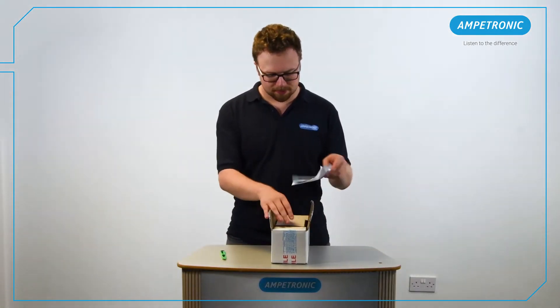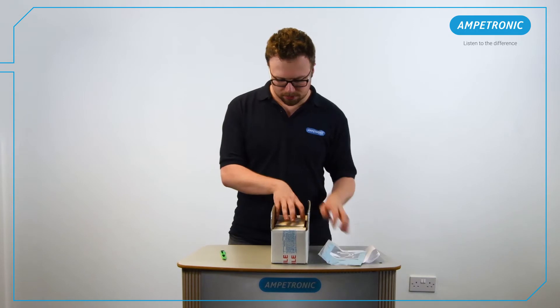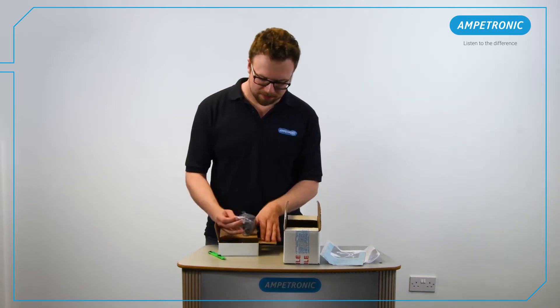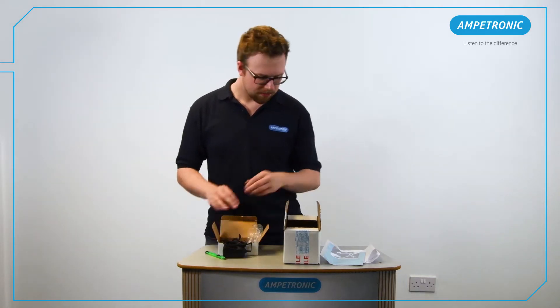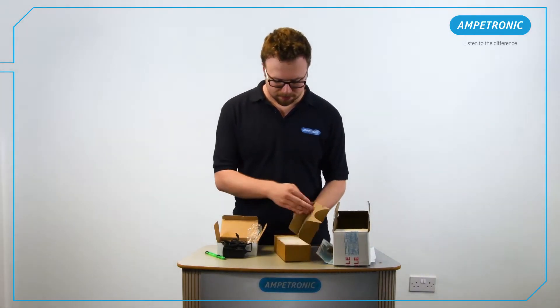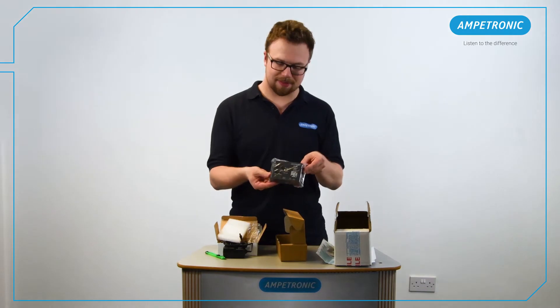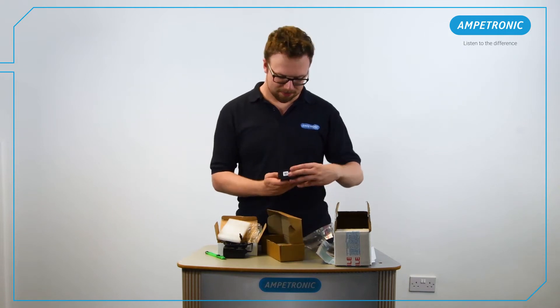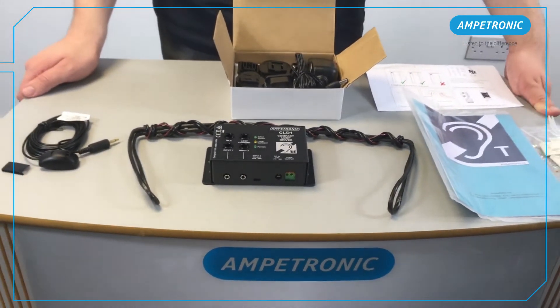These are some of the most common induction loops and come in simple, off-the-shelf kits. When you open a CLD1 kit, you will find several items in the box. Some of these will depend on the exact model that you have purchased. The model we are showing here is a CLD1CB, which comes with a multi-region external power supply and a boundary microphone, as well as the standard accessories including the handbook, installation loop sticker, loop coil and fixing pads. There are desktop and tie clip microphone versions available, as well as an AC variant, which is a slightly larger amplifier that takes a direct mains voltage power supply. Check the contents of your box and make sure that you have everything necessary to complete the installation.